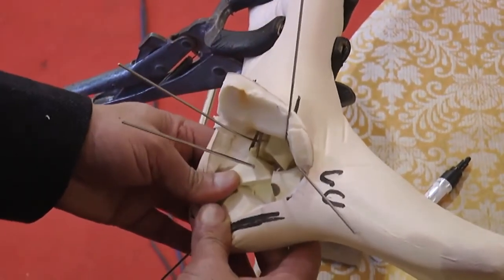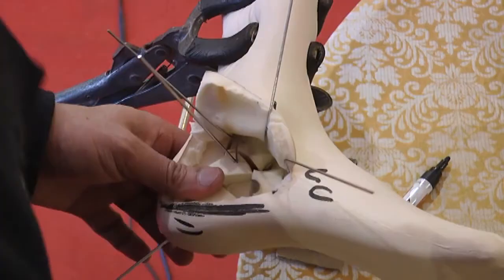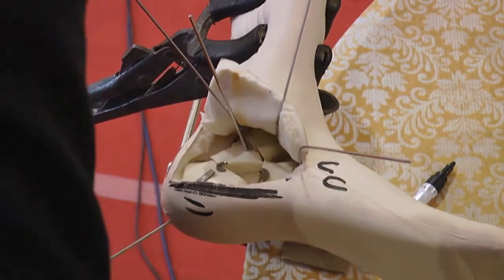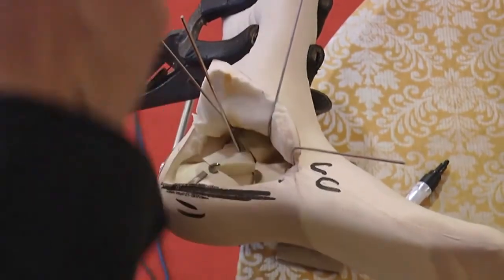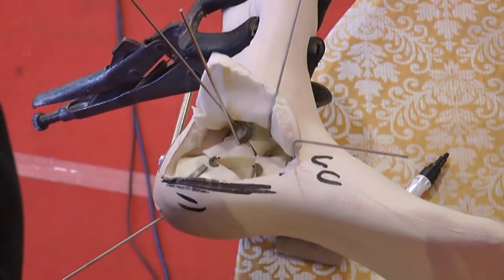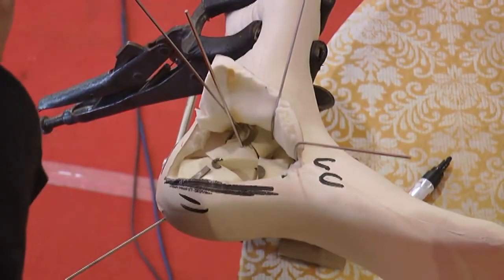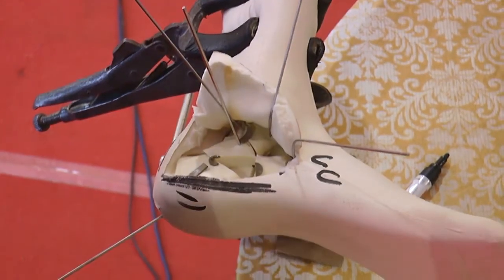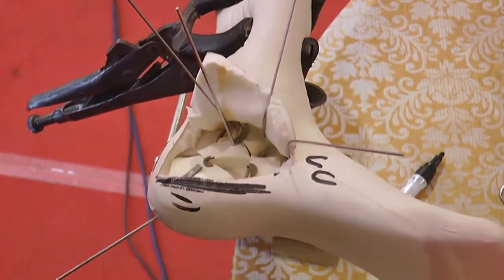If you really want to look at the joint surface, there are a couple of options. If you just do a heel inversion at this stage, most of the times you are not able to look at the fracture line. So if you have a small distractor, the Hintermann distractor which I showed in the video, you can put one pin in the tuberosity and one pin in the talus and distract it and see that the joint surface has been reduced well. The other way is obviously to do a C-arm, Broden views and lateral views and axial view. All three will show you the surface of the joint, and you can see that there is no step. If you are good at doing Broden view, you can very well see the fracture line and the joint surfaces.